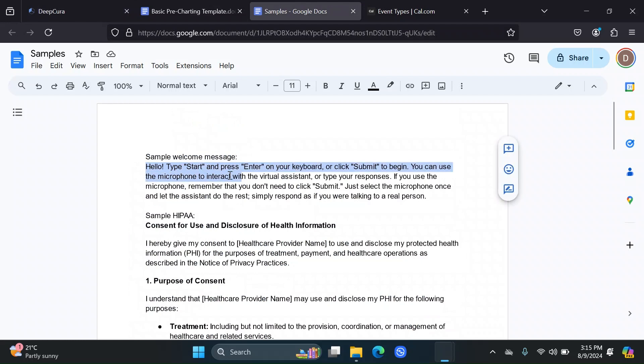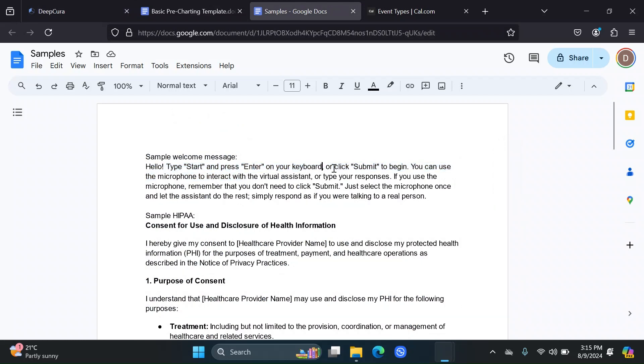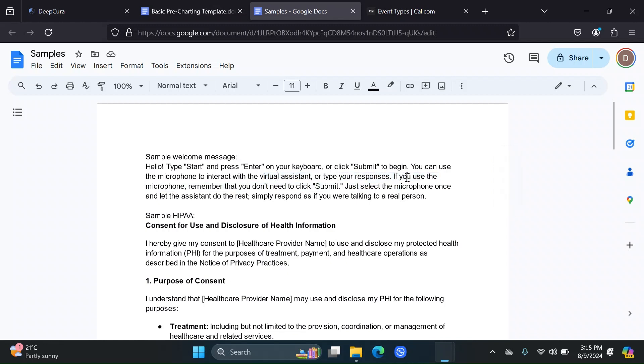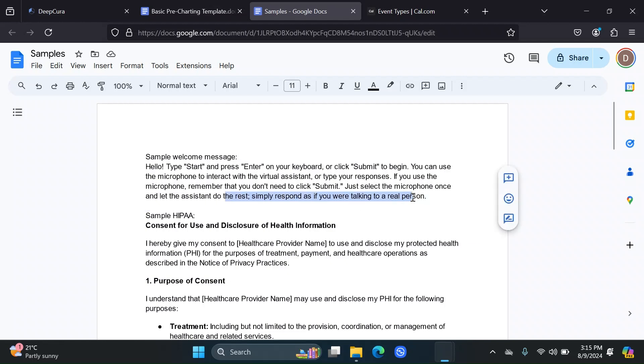Hello, type start and press enter on your keyboard or click submit to begin. You can use the microphone to interact with the virtual assistant or type your responses. If you use the microphone, remember that you don't need to click submit. Just select the microphone once and let the assistant do the rest. Simply respond as if you were talking to a real person.